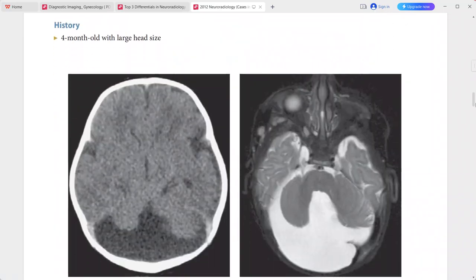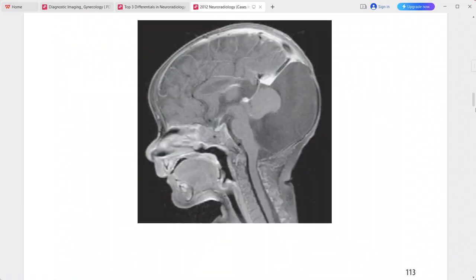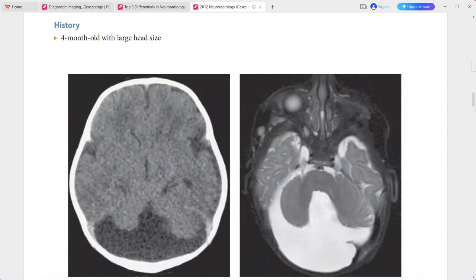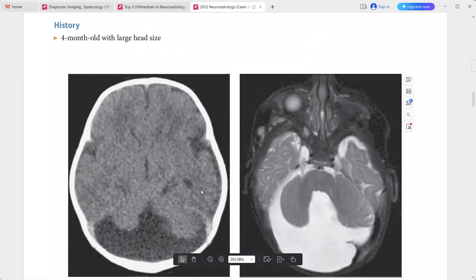Next: a 4-month-old child presenting with large head size. CT and MRI show an enlarged fourth ventricle with cystic dilatation of the posterior fossa. The torcula is located much more superiorly than normal.